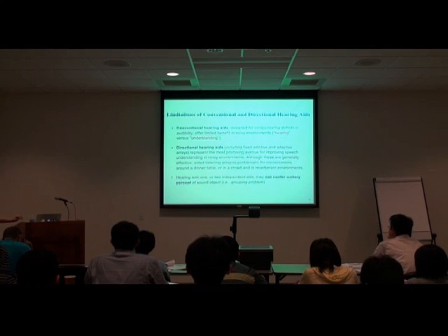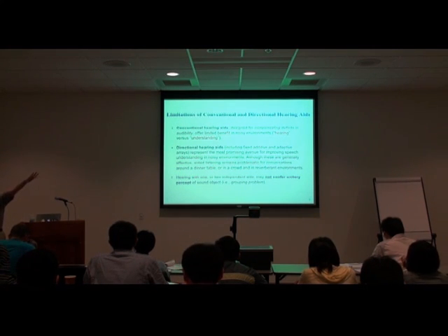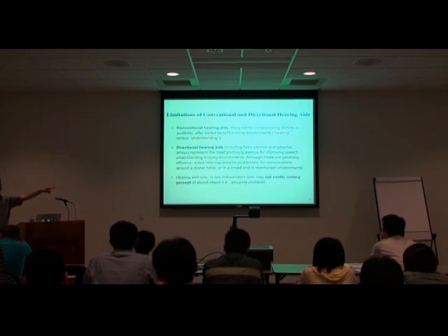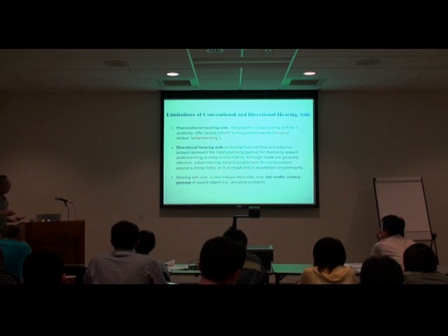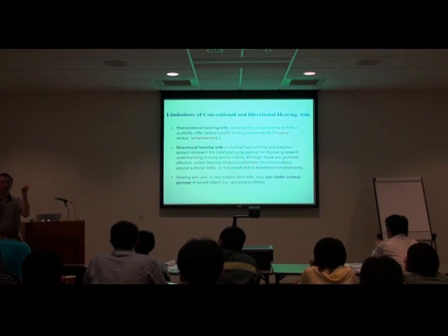But most of the solutions are not particularly effective or not practical. They're good at separating sound in front of you versus sounds behind you. But if you want to discern the sound from multiple sources in front of you, those are not good enough. The third problem with hearing aids is that if you wear one, you have a problem.